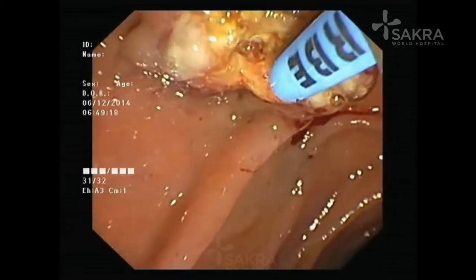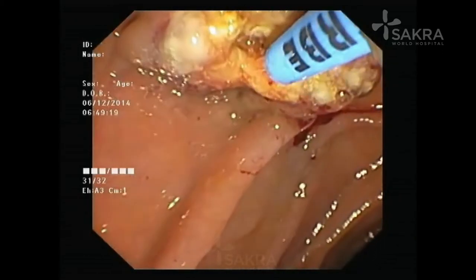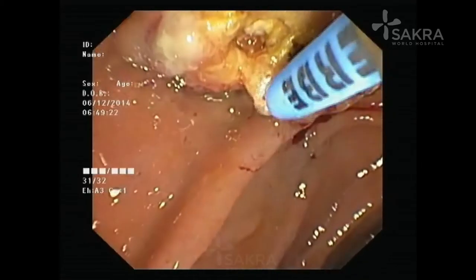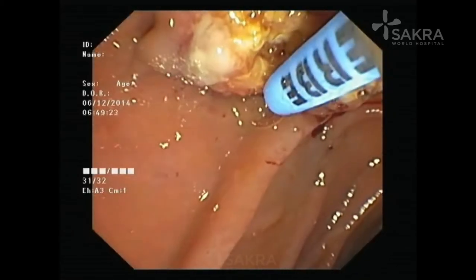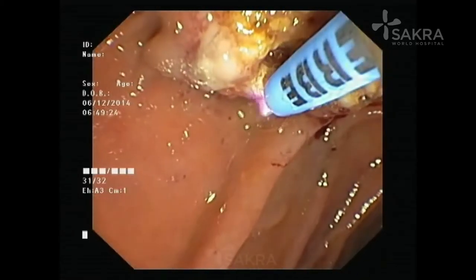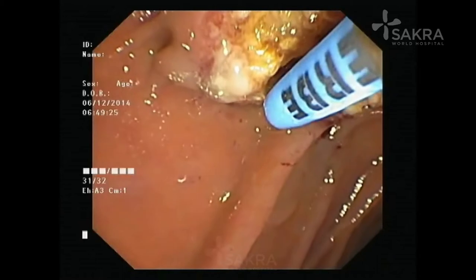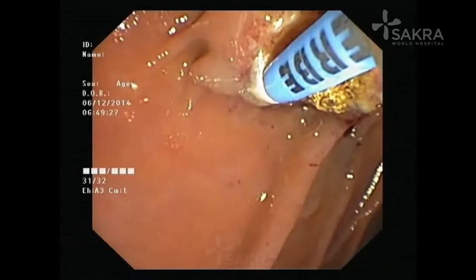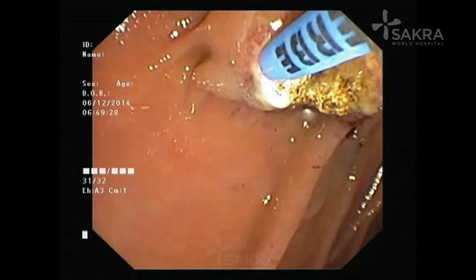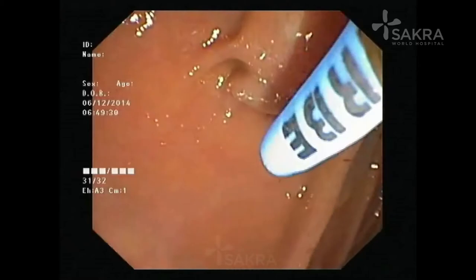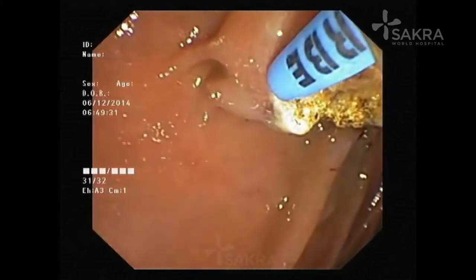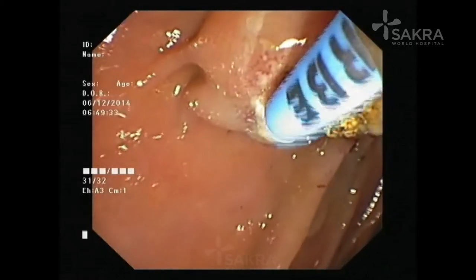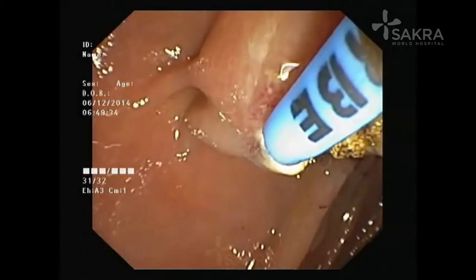Another important step to prevent complications is to stent both the biliary and pancreatic ducts. We also use coagulation to ablate any residual tumor tissue. You can see the APC — argon plasma coagulation — being used to ablate the residual tumor tissue at the resection site.